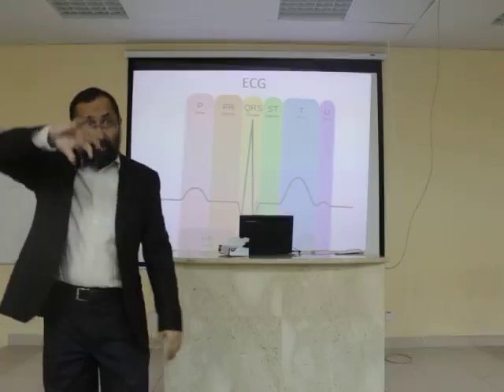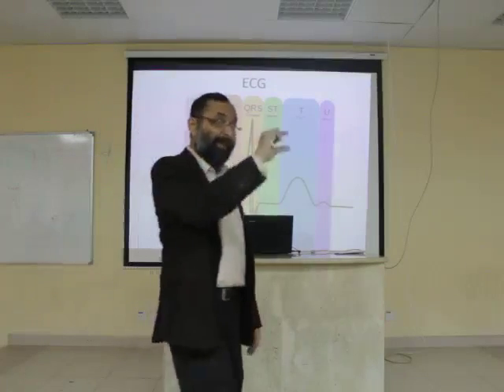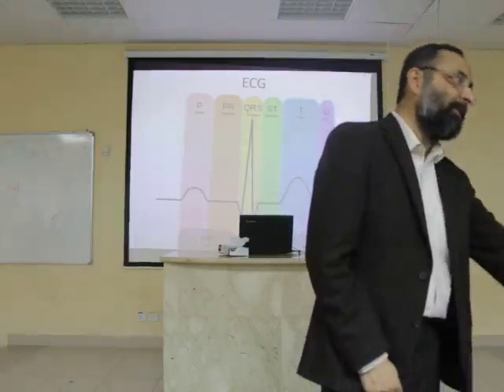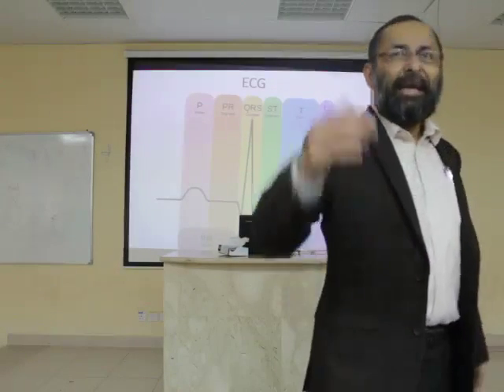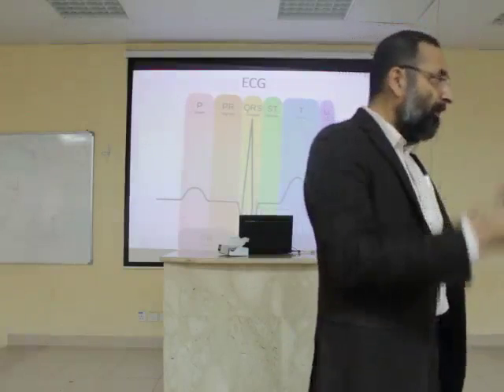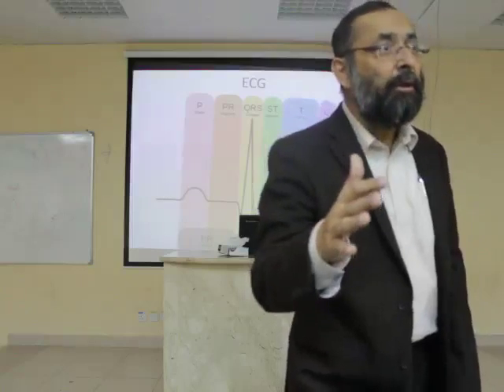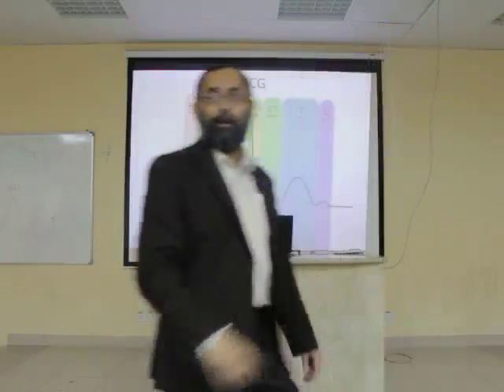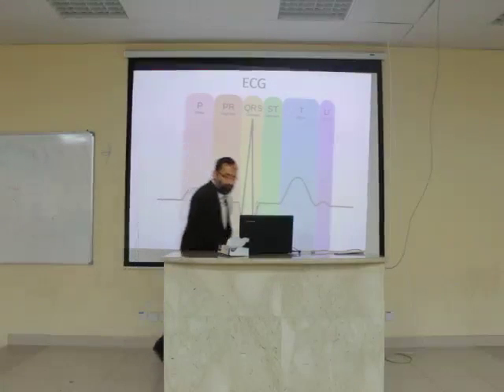A small U wave here and there in the ECG is not a big deal. It's okay. But regular and consistent U waves coming in many leads and big size, that is showing you some electrolyte disturbance, which I am not discussing now. So U wave is an inconsistent but a normal phenomenon. Why? Last part of repolarization, which part? Papillary muscles, they are repolarizing slowly. So sometimes you see it, sometimes you don't.